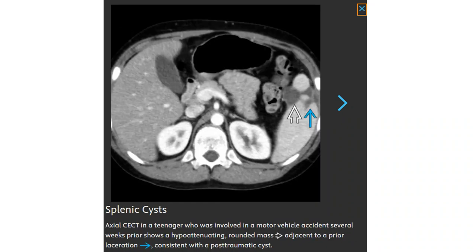Contrast-enhanced CT in a 10-year-old girl who was involved in a motor vehicle accident several weeks prior shows a hypo-enhancing round mass adjacent to prior lacerations, consistent with a post-traumatic cyst.